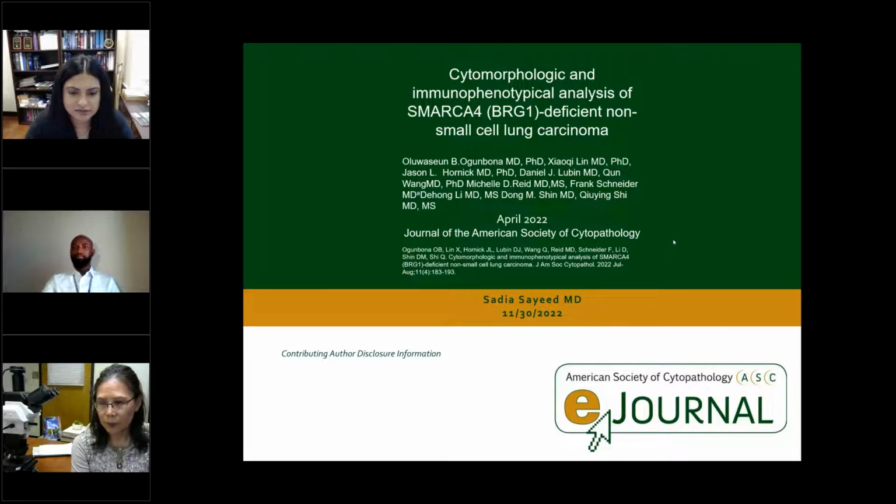Thank you so much, Dr. Reid, for that kind introduction. I'm here to talk about a very interesting article that I came across called the Cytomorphologic and Immunophenotypical Analysis of SMARCA4 or BRG1 Deficient Non-Small Cell Lung Carcinomas. And I'm very fortunate to have some of the authors of this study with me on the call today to present this. So the format is going to work like this: I'm going to be sharing a PowerPoint with some of the important findings from this study. Throughout the discussion, I'm going to ask some questions of the authors that are here with me so you can get their ideas and their thinking behind what was written.